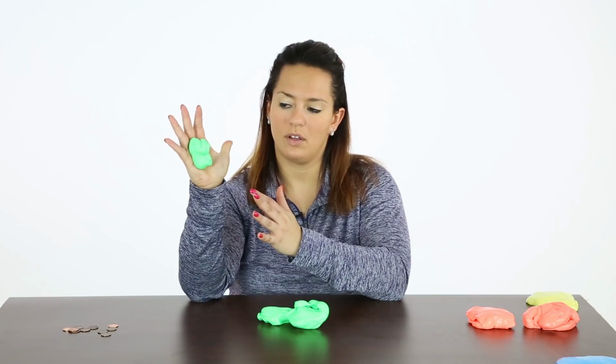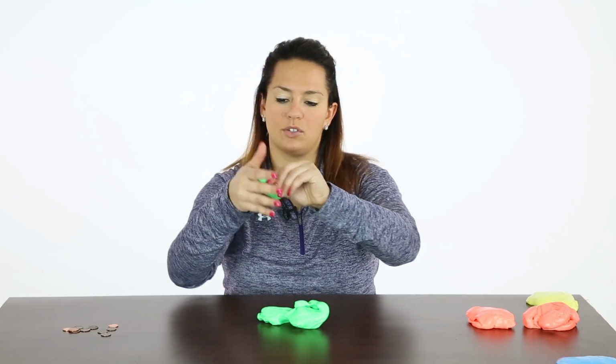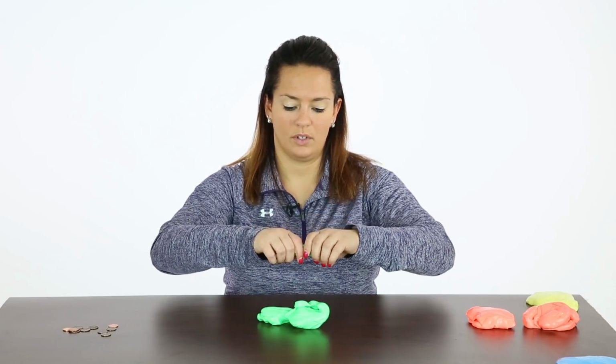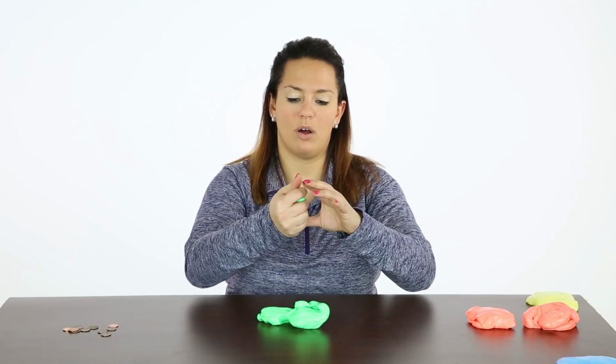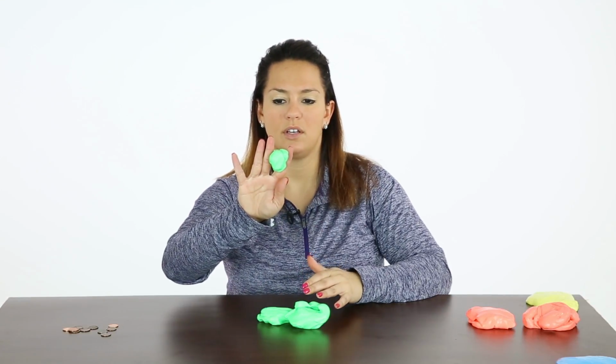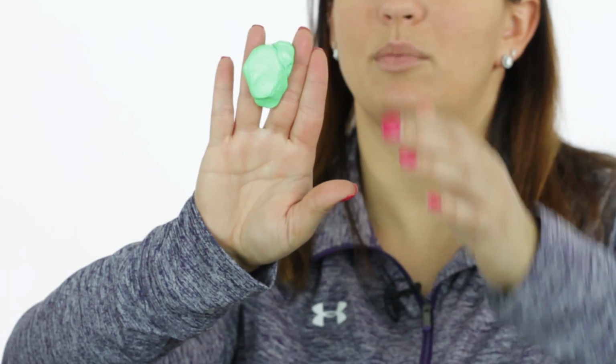So going all the way over to your pinky side and all the way out, requiring some in-hand muscle strength here. We can use a small ball. So we did strength of the thumb. You can also do that between the fingers, kind of like a scissors, just really pushing the putty in together between each finger.